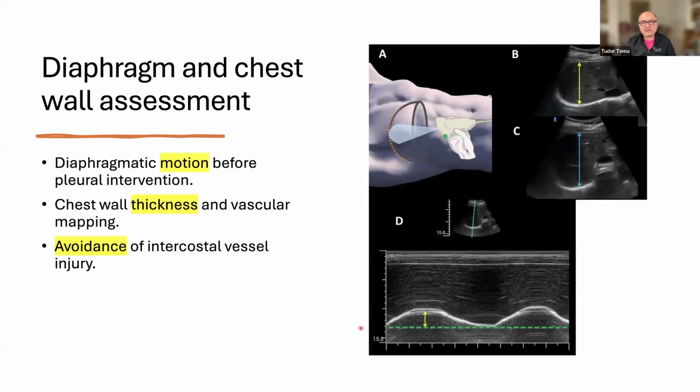In terms of diaphragm, for the pleural pathology in particular, it's very common to be asked by other specialties, by internal medicine, by emergency medicine, to drain a white lung. But most of the times the white lung is a pleural effusion, but most of the times it's not the pleural effusion which is contributing to the shortness of breath of these patients.